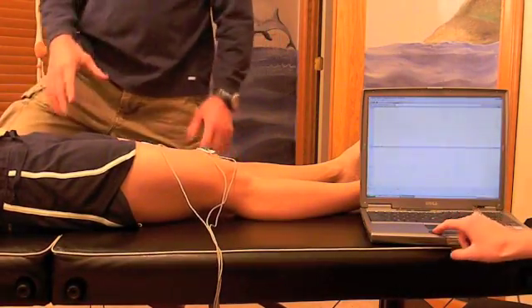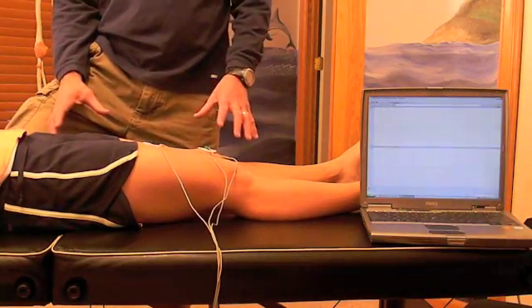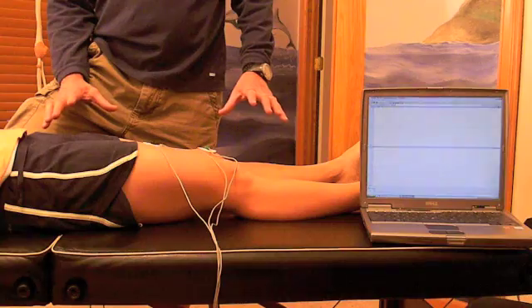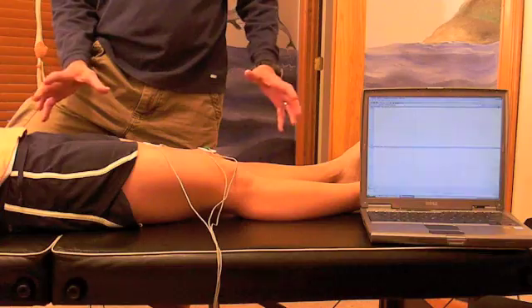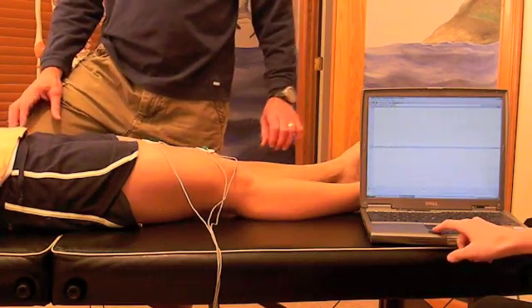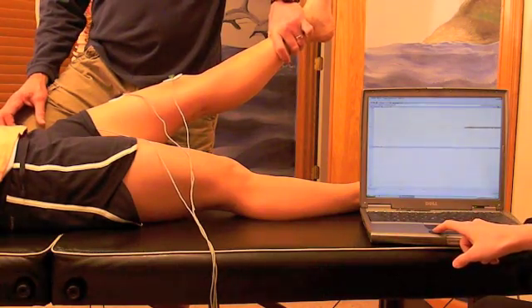We're going to do some muscle testing on the rectus femoris. Dana is eight weeks post-surgery, so we're going to do a baseline test first. We haven't done any strengthening whatsoever — we want to see what kind of readout she gets on the baseline test. Dana, go ahead and lift your leg up. Hold there. Ready — resist.